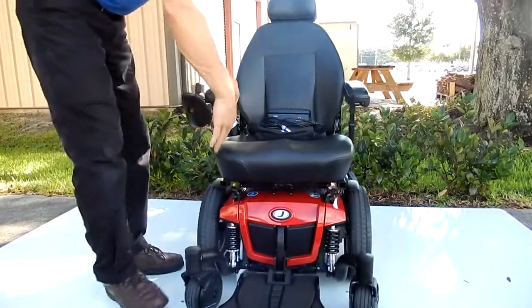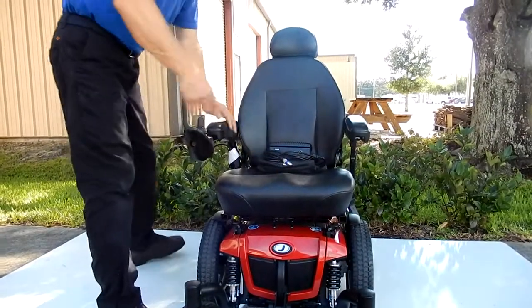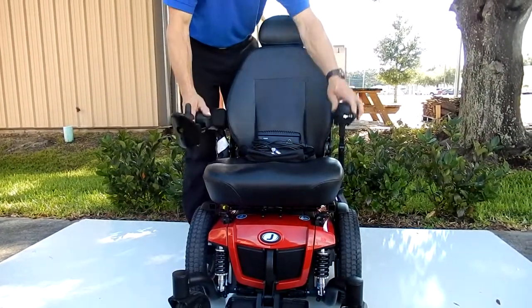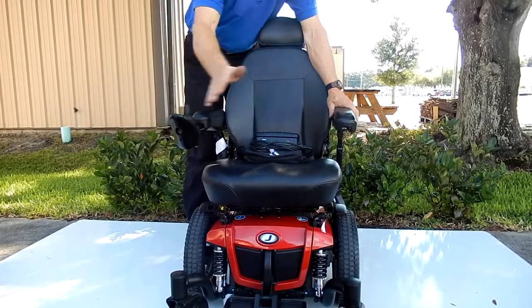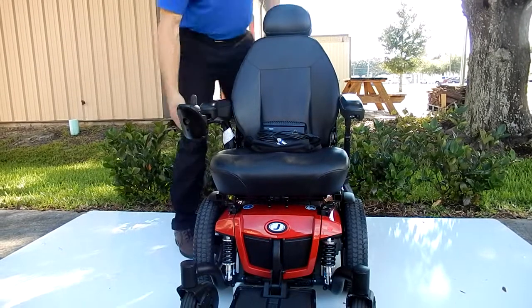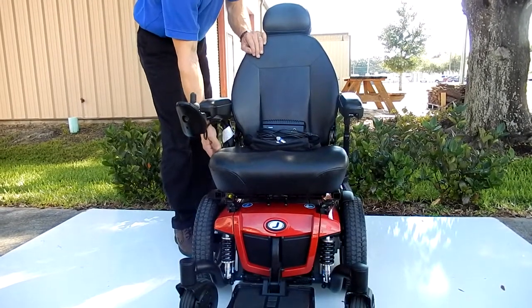The seat on this chair is 18 by 18. The arms are adjustable up and down, and the joystick can go from the right to the left if needed. The arms are also adjustable outward, and the seat is adjustable back and forth.